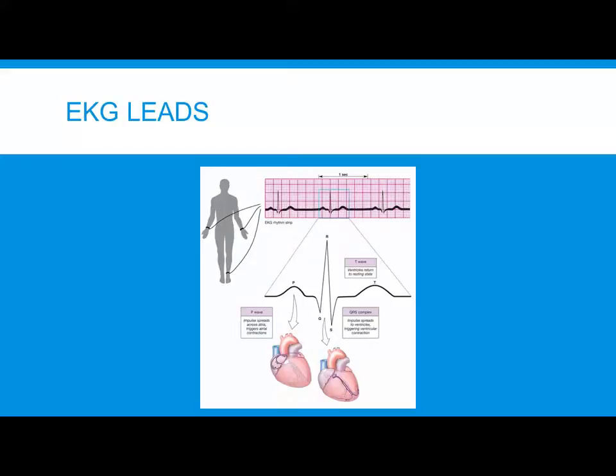Now, just by looking at this, without us getting too deep into the voltage right now, why do you think that the QRS complex is so much bigger than the P wave? Think of the size of the ventricle compared to the atria. The atria require voltage to contract, to have their action potential, right?